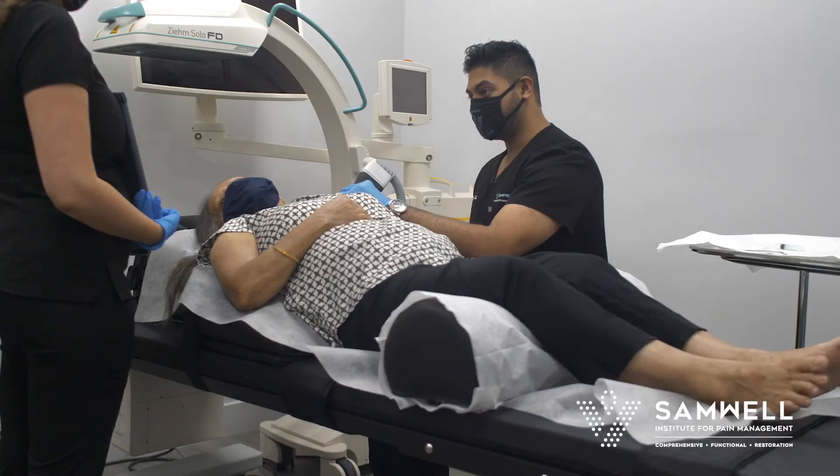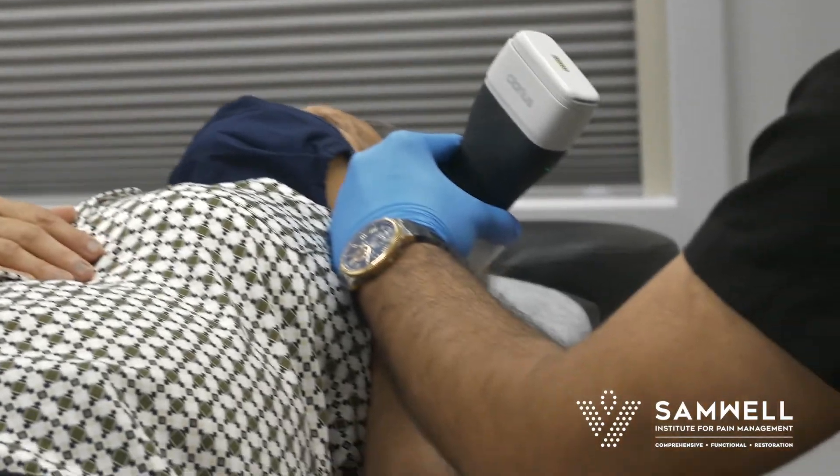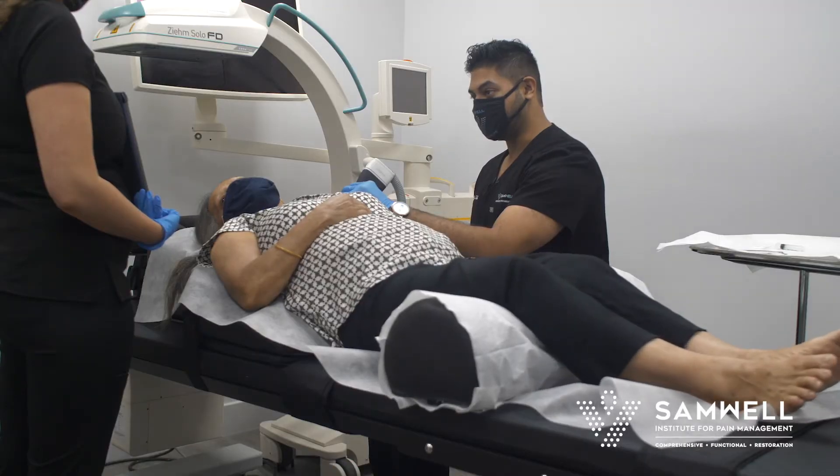Where I'm pushing right here — is that typically where you feel a lot of the pain? Yeah, okay. Now we're just evaluating right over that area.